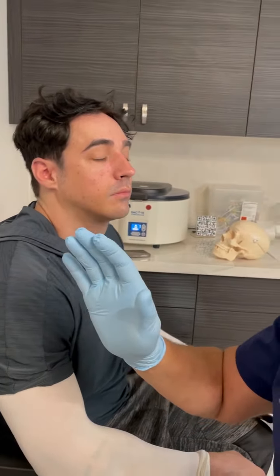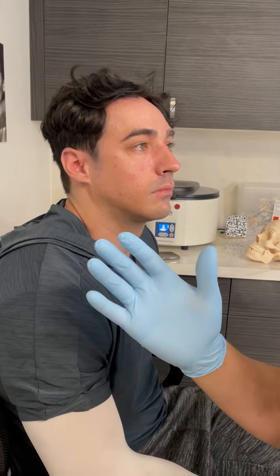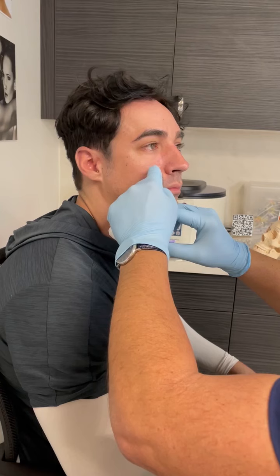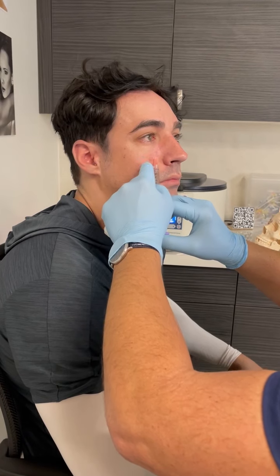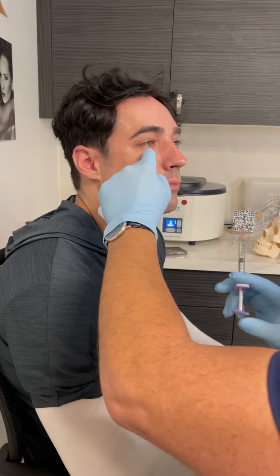The only filler that can go in the tear troughs is Restylane, which is 20 milligrams of hyaluronic acid. You can never put 24 milligrams of hyaluronic acid, which is Juvederm, in the tear trough. What that means is the tip of the needle should be 1/2 inch away from the tear trough. Why 1/2 inch? Because the needle is 1/2 inch long. So watch. I want the product to lay right here at the zygomatic arch, not in the tear trough.